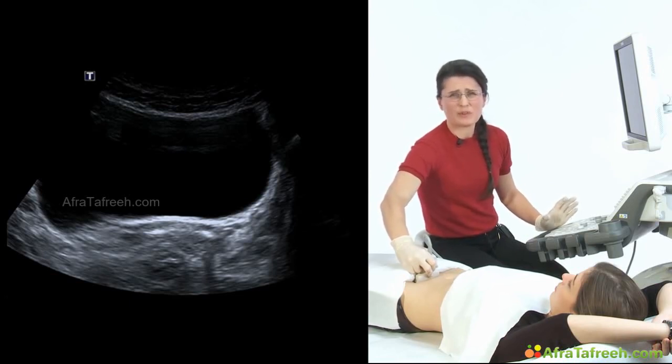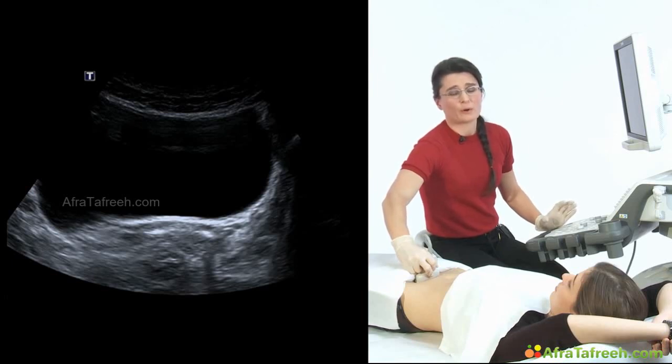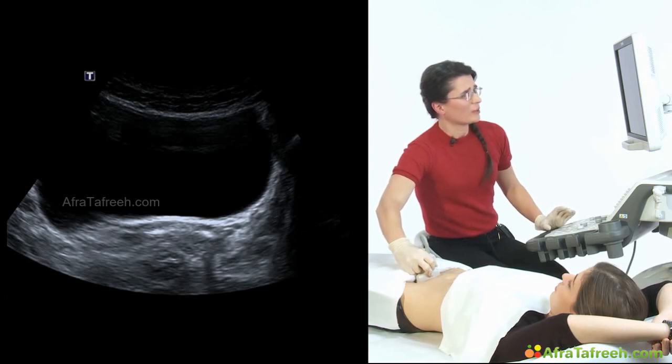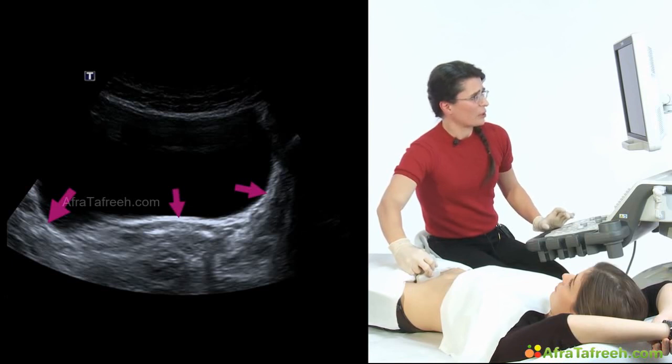Sometimes you can see some reverberations, some artifacts, but we would refer to that in our course of basic abdominal sonography. Around the dark fluid, you can see the white border of the urinary bladder. It's the wall.